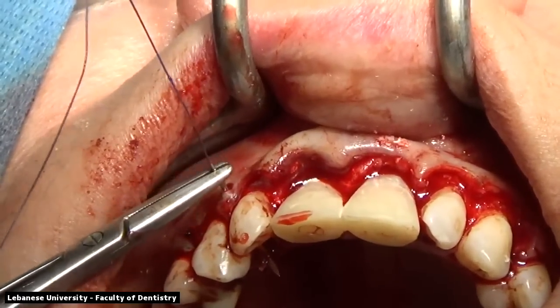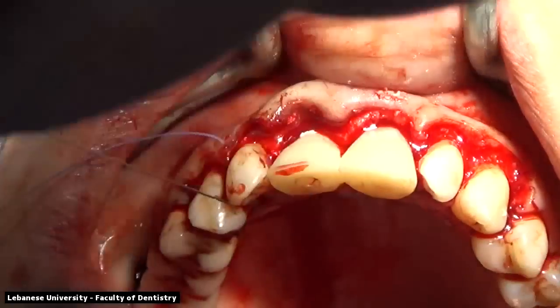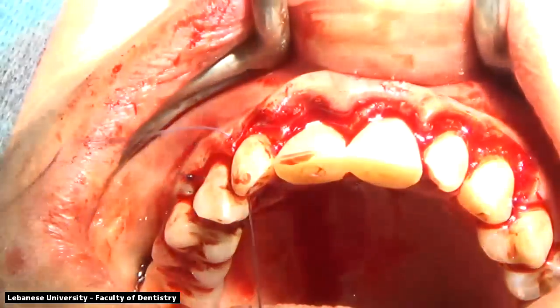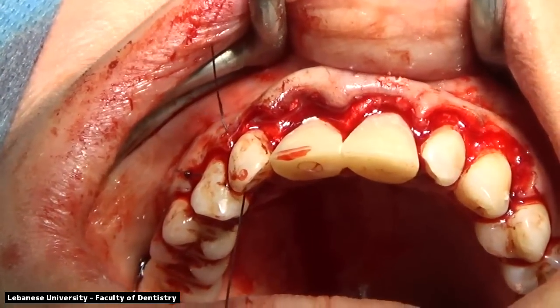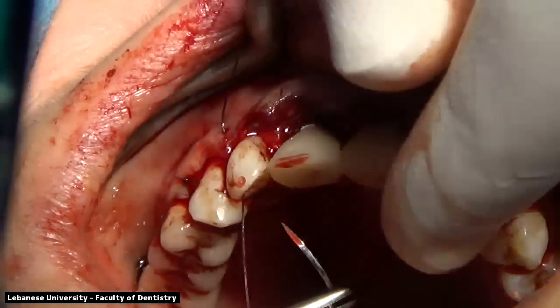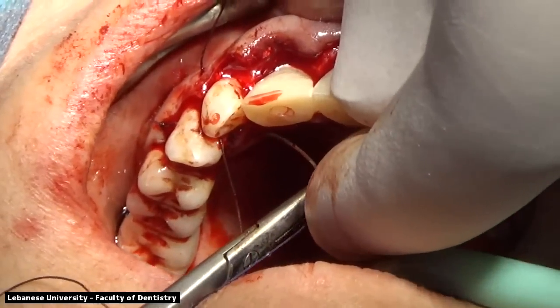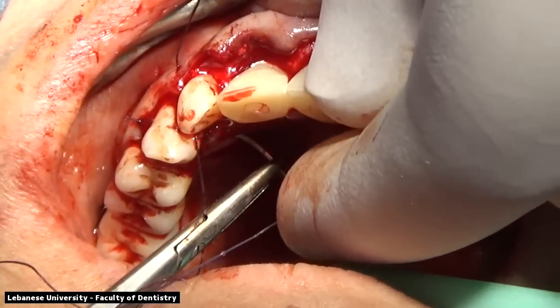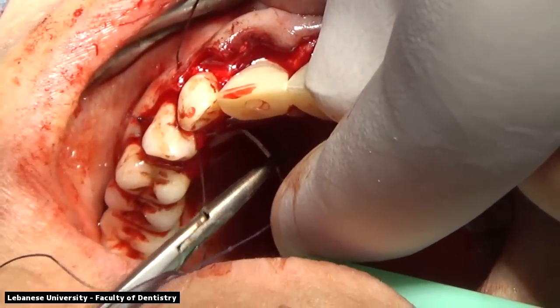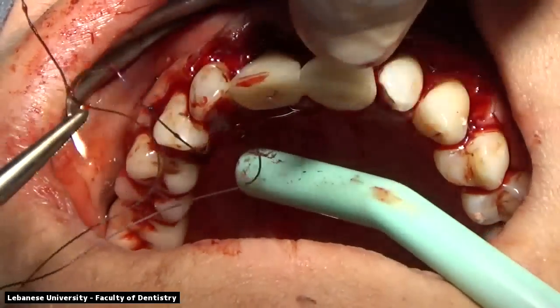Since we already did the ostectomy and osteoplasty prior, the osteoplasty will allow the proper adaptation and the scalloping of the soft tissue without any gaps between the cementoenamel junction and the soft tissue profile. So we will have a flush soft tissue to the tooth surface, and this will prevent the seepage of the blood and will allow for better healing and better adaptation and prevents the bone resorption later on and remodeling.